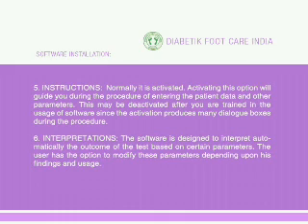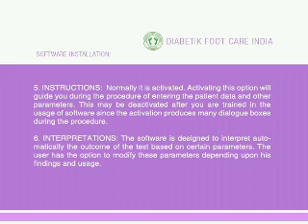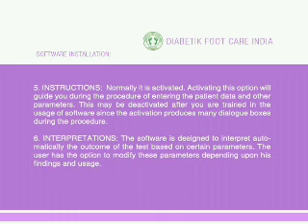Instructions: Normally this option is activated. Activating it will guide you during the procedure of entering patient data and other parameters. It may be deactivated after you are trained in the usage of the software, since activation produces many dialogue boxes during the procedure.